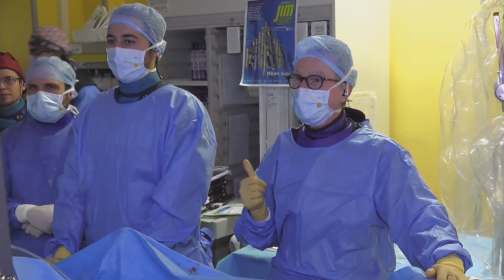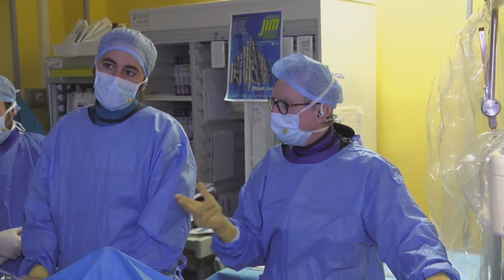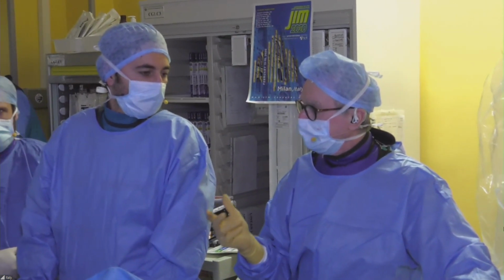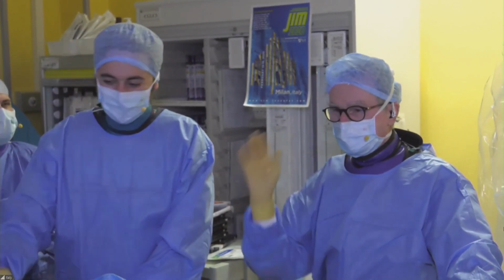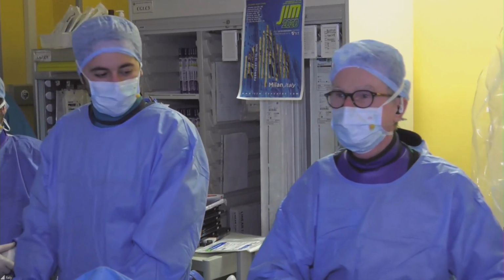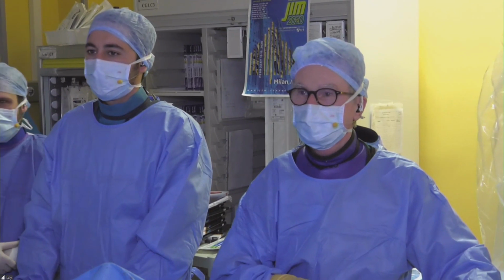I think two lessons: IVUS to tell you the size, pressure wire to evaluate the result, and other people to listen to suggestions. Perfect. Thanks a million, Antonio. Great case. Thank you very much. Bye-bye. Congratulations also to your co-workers. So now we are going back to Dr. Giannini in the other lab. Perfetto.